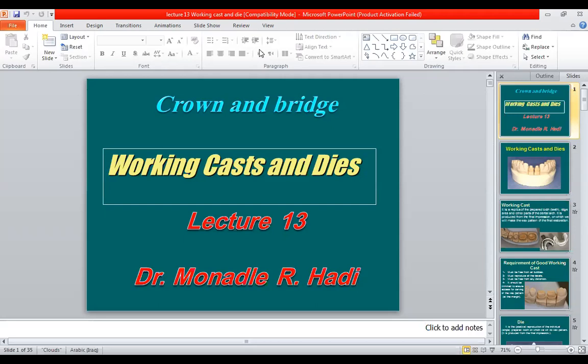In the last lecture we talked about the impression, and we said that the final impression is the important clinical step during this treatment. After we take the impression we are going to go to the laboratory or to our clinic, and we are going to pour the impression.